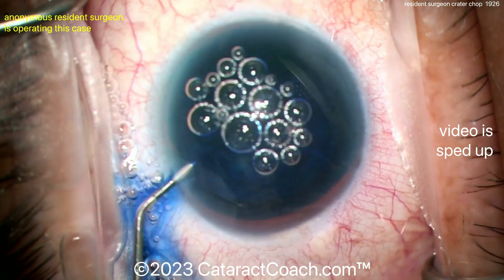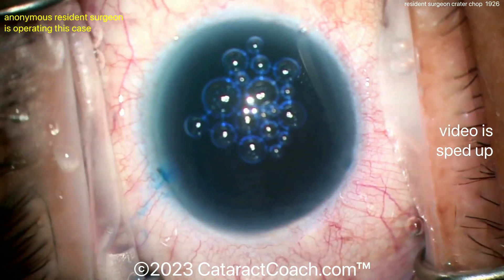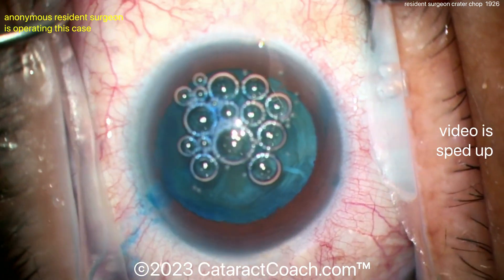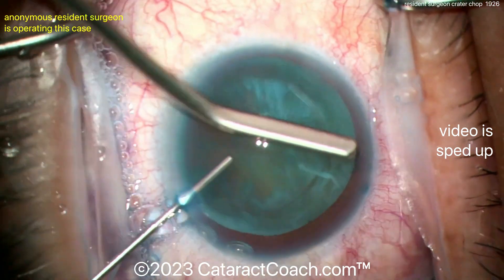Some trypan blue dye goes in — this part of the surgery is pretty routine. Get a good stain on the lens capsule. I do like the positioning of the eye; the iris is parallel to the floor of the room, the draping is good, the lid margin is sequestered.